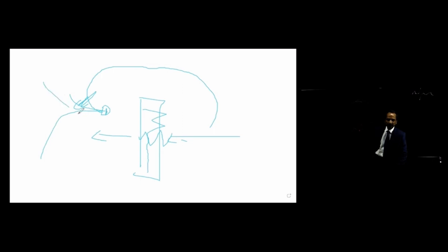Now we get a little better when we have a multi-electrode catheter. We get even better if we span that multi-electrode catheter, moving it from all sides of that isthmus to see if in any place we see distal is earlier than proximal activation. Still can be difficult in some cases, multiple ablation, longitudinal lines. Then we do have to do a high density map to try and clarify if activation is going through.